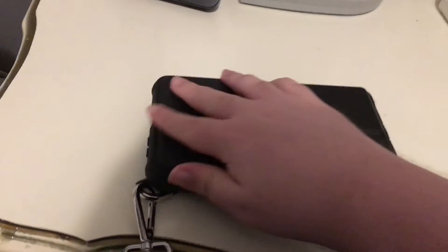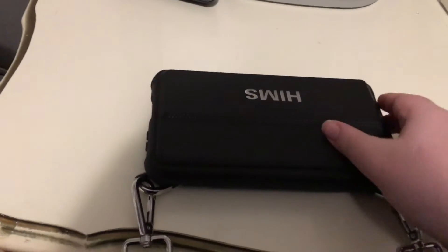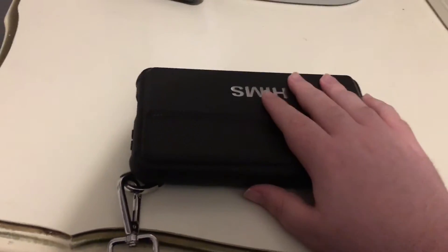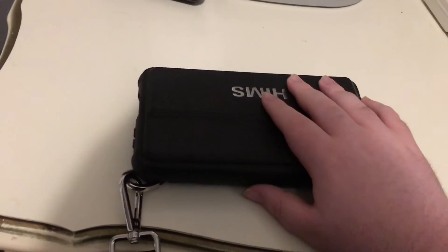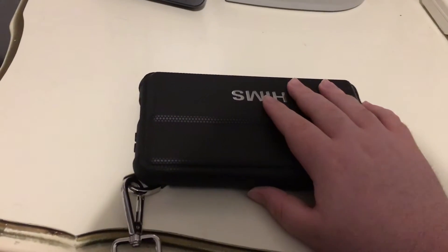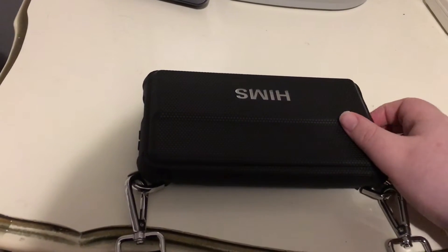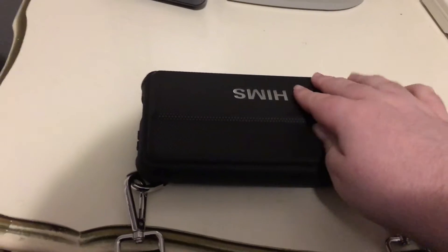I'm going to give you a tour of it in this video. This is a really nice device. I'll show you around it a bit, and then we'll do a quick boot-up and take a look at the software — just to see how long it takes to boot, that sort of fun stuff.